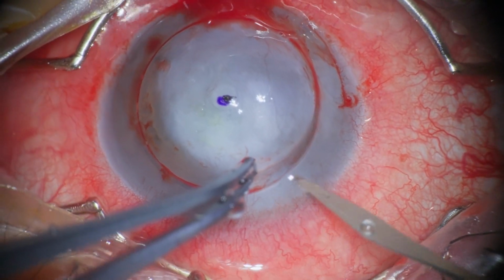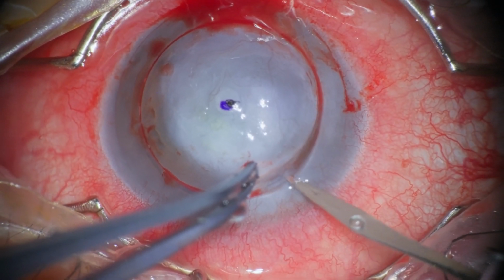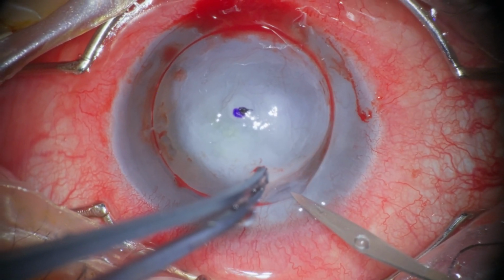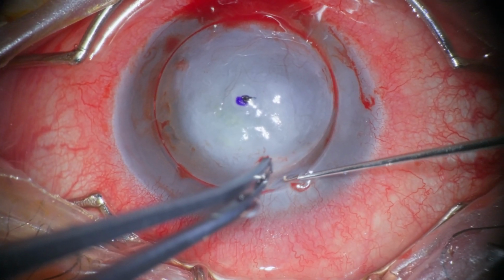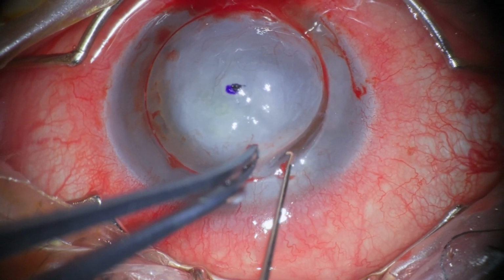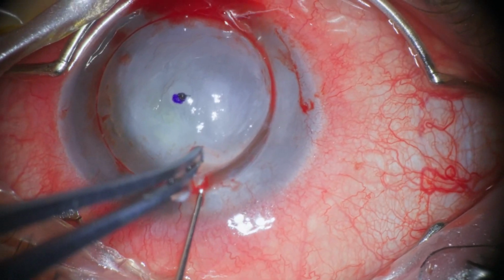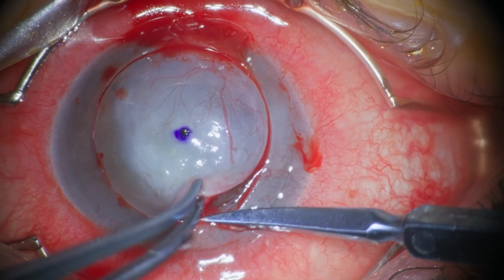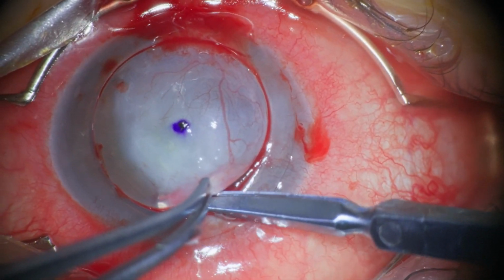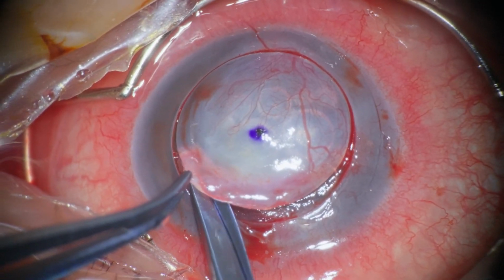We do our usual DALK technique, which involves partial trephination, probably to 450 or 500 microns, and then deepening the trephination groove with a 15-degree blade, and then bluntly, forcefully dissecting with the Sinskey hook. In that plane that we created, we use the Vannas scissors to bluntly separate the corneal lamellae, trying not to perforate.